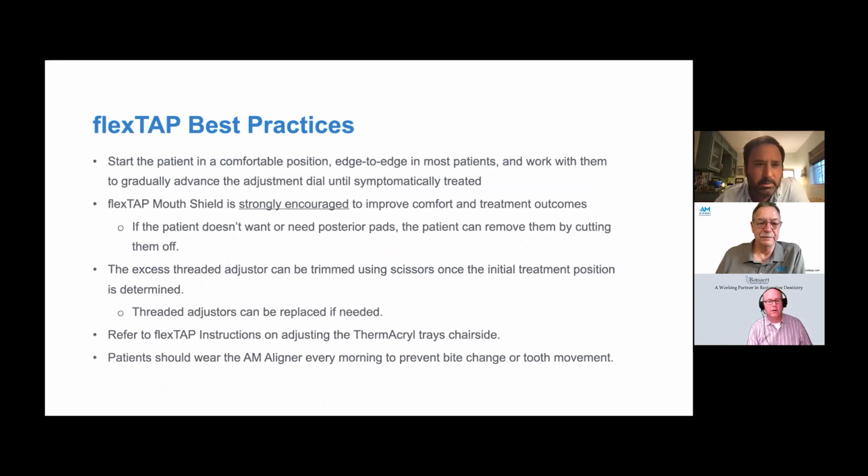Yeah. Okay. We had in the chat room somebody asking if there's no bite registration, then from what point is the 14 millimeters of the protrusive in reference to, and how can I be assured of those 14 points? And we have another questionnaire also as you answer this. Yeah, go ahead and answer your level of expertise.